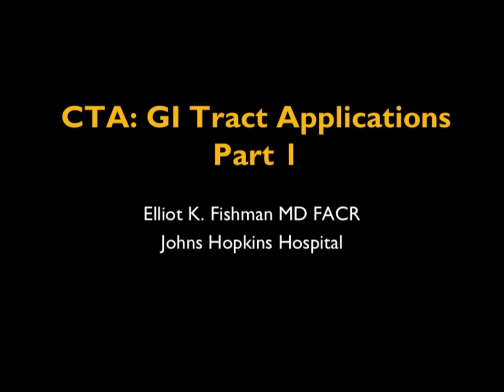And what I'm going to try to do is go through some of the classic applications that we are using CTA for, and perhaps these are some that you're not doing, and this may get you started.